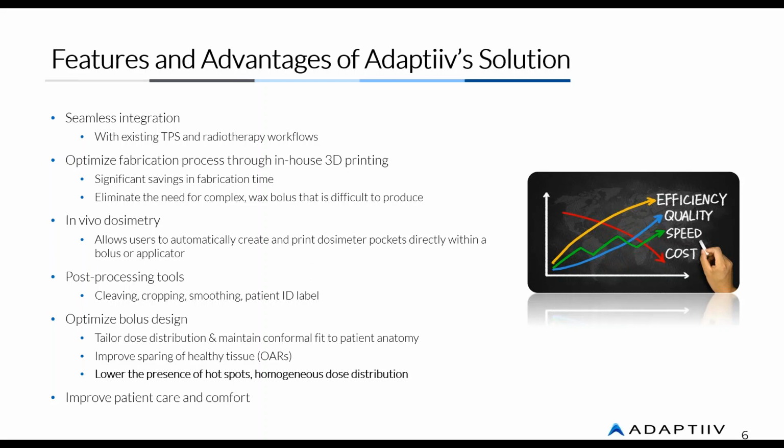Yeah, so I would say with increasing the field size, of course, the scatter will be increasing. At the moment, I don't have any data that show that. We haven't performed any investigations on that part, but I would say that the biggest limitation in this sense is maybe not the field size, but the modulation of the bolus.